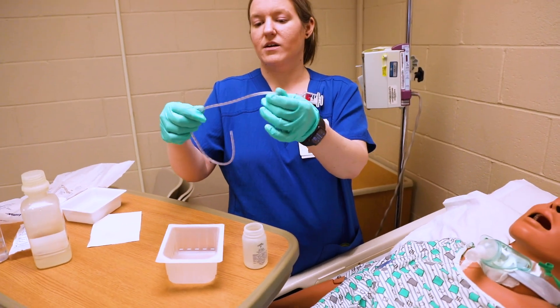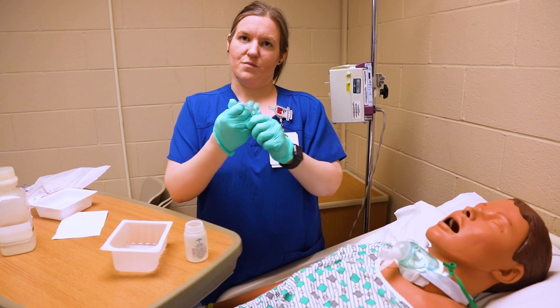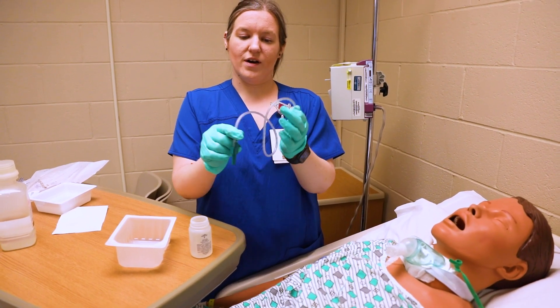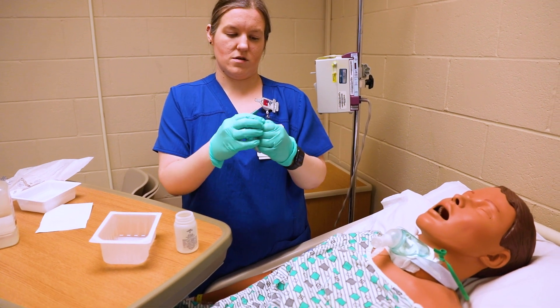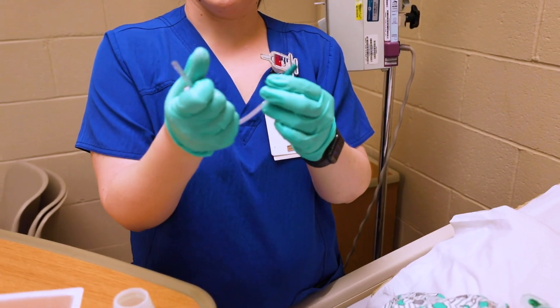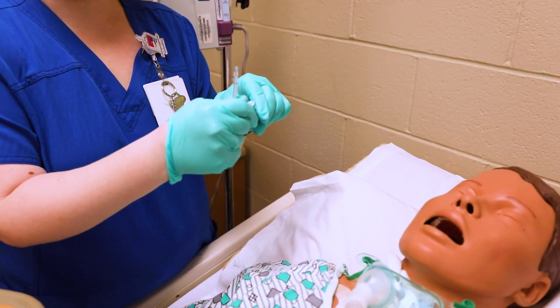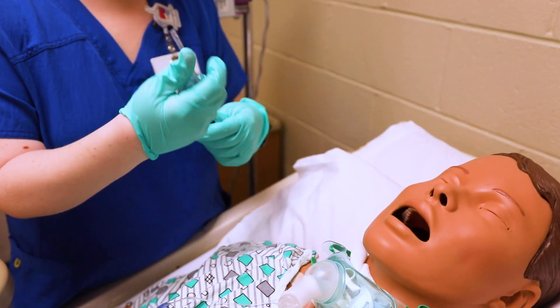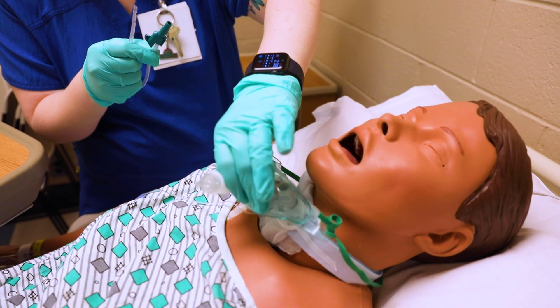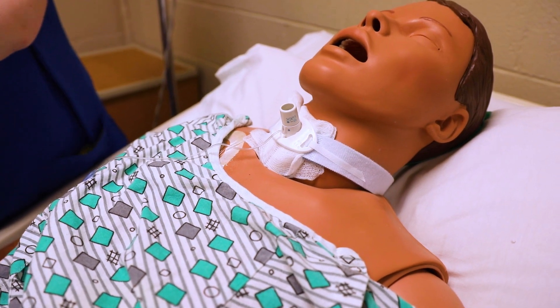I'm still sterile. I always like to loosen up my tubing a little bit to make it more pliable. After I've done that, I want to go ahead and coil this up in my hand so I don't have tubing just hanging around. Since I already have my suction, I will hook this up to suction. I've also poured a little of our water into the tray.